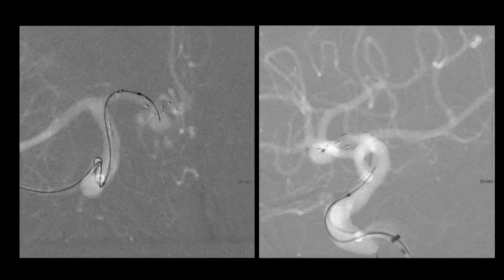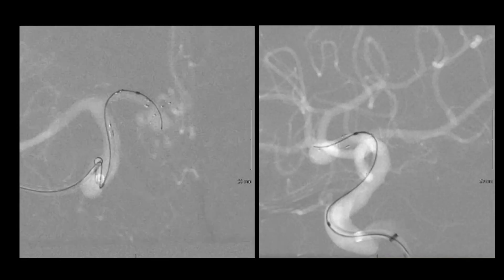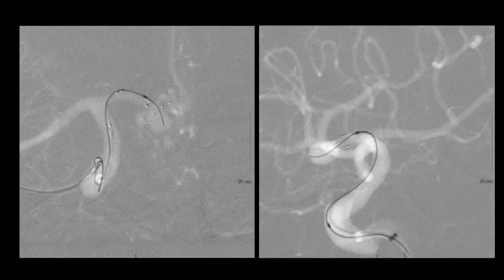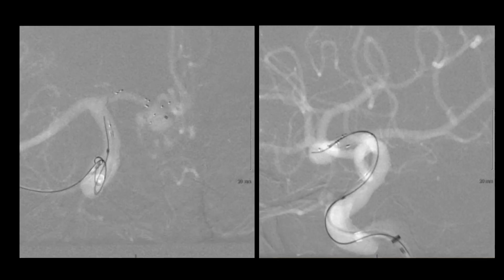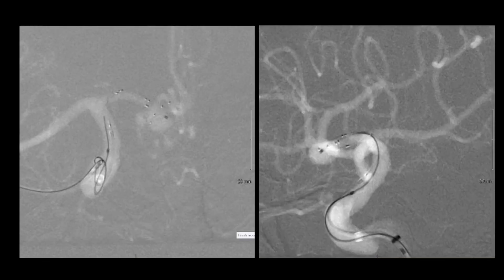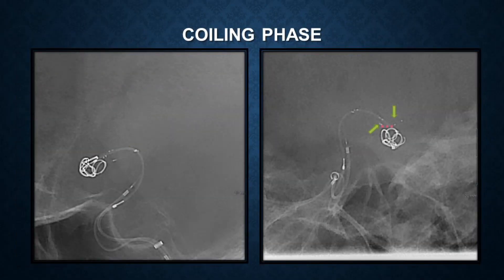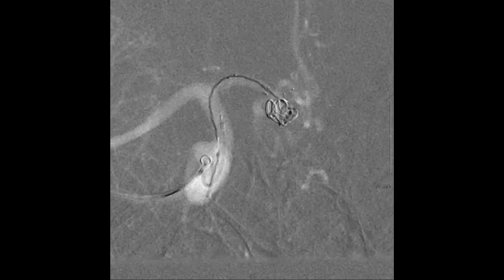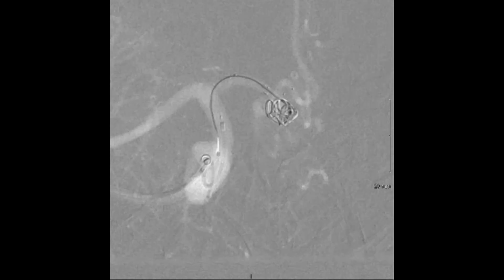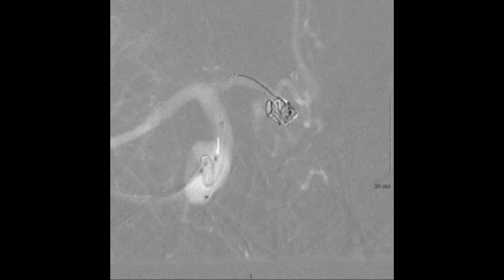The device is then traversed with the microwire, and the aneurysm is accessed with the microcatheter. The framing coil has been placed, and the arch markers can be seen demonstrating the support for the coils. The aneurysm is then fully packed with coils to satisfaction.